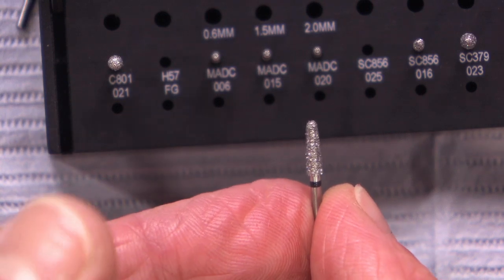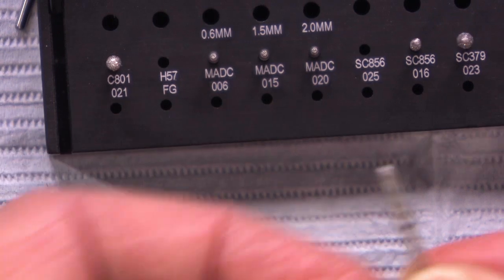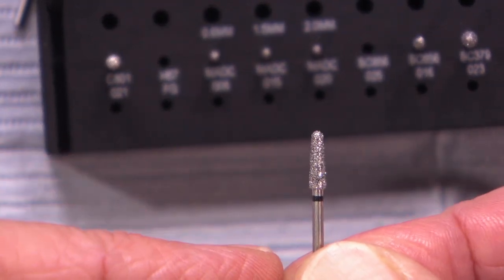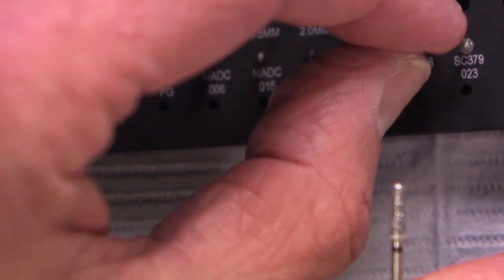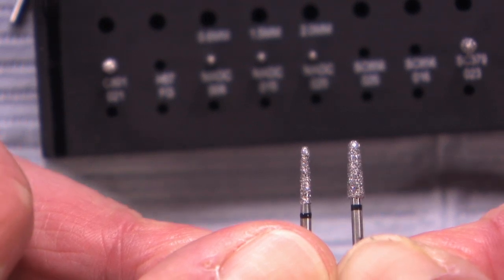So even though it's very coarse and removes tooth structure very quickly, because of the depth cuts, we're able to use this in a manner to very quickly prep the tooth because we know exactly where we're going with the depth cuts. And then the other burr next to it, the 856016, is the same burr, same shape, same grit, just a thinner burr.